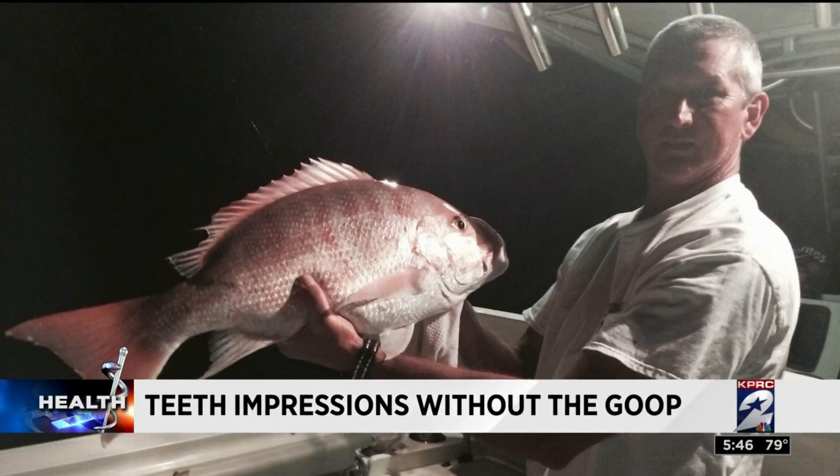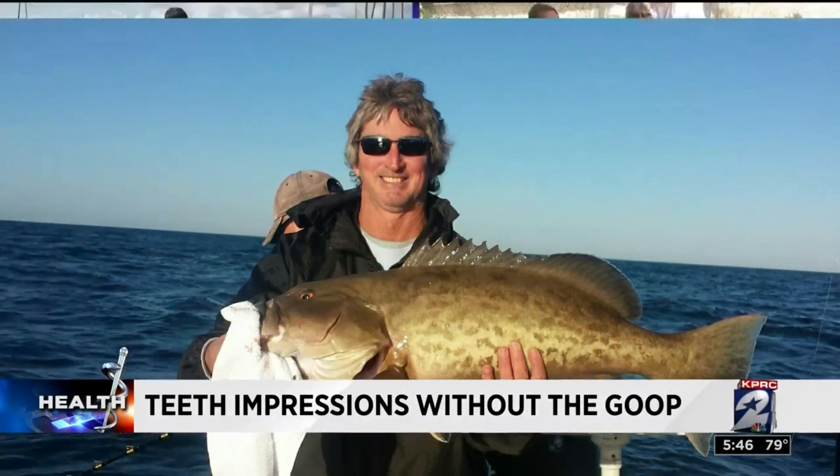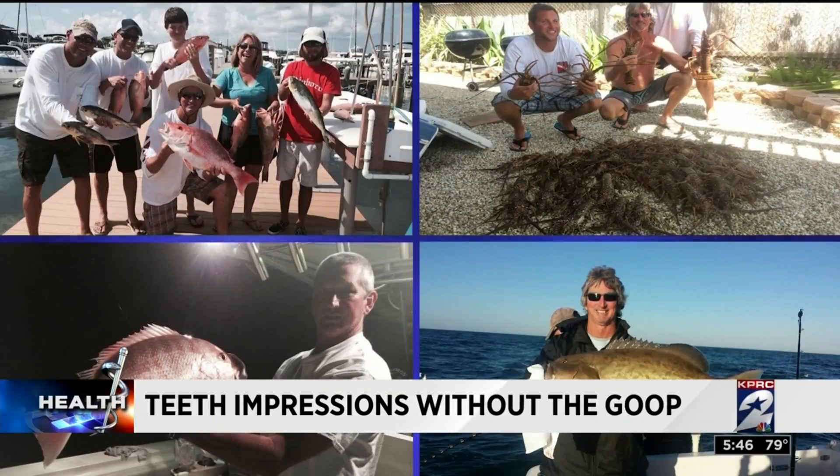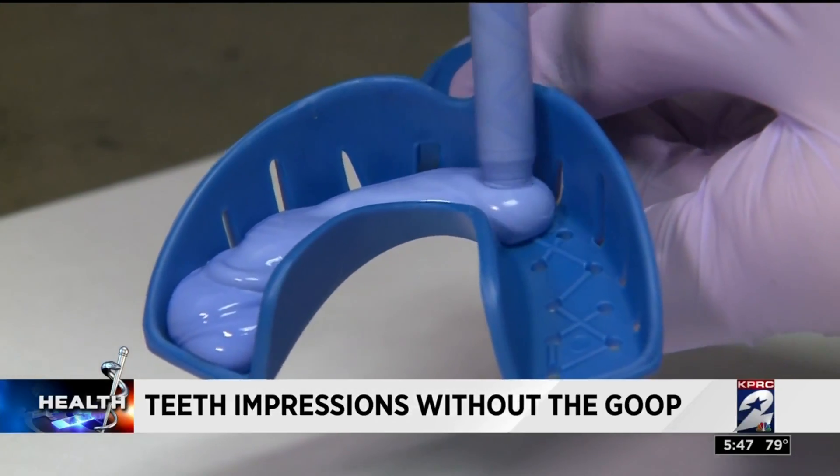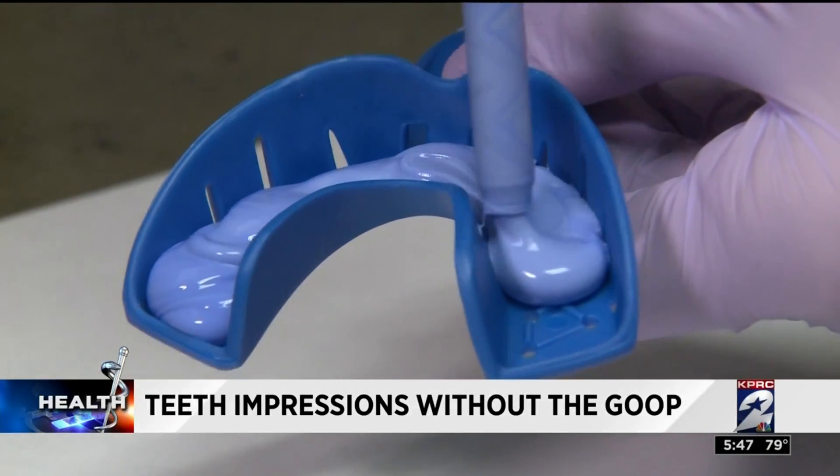Terry Brown has loved to fish all his life, but what he hates is going to the dentist. Just choking, you know, like making you feel like you're choking. He can't stand the goop — it's like adult Play-Doh dentists have used for years to make impressions of teeth.